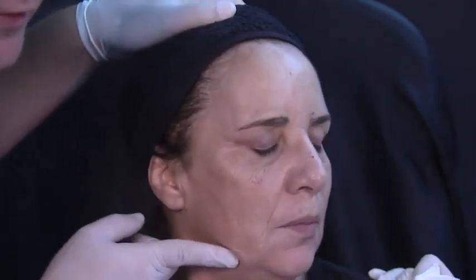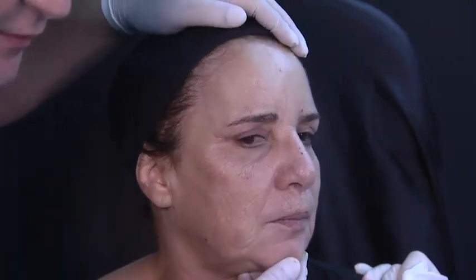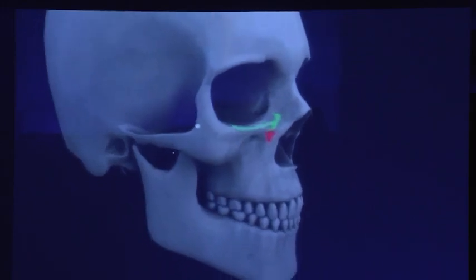Look at this. Okay, look at the saggy skin down here. Okay, and look at this side. We're starting to improve the saggy skin. Okay, and look at also this. We're starting to improve the nasolabial fold. But she obviously is an older lady that needs additional treatment. So let's go to the nasolabial fold itself now, okay?